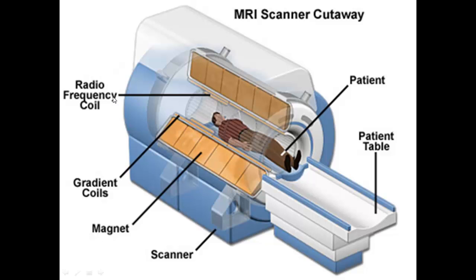And then we use these radio frequency coils to fire radio photons at the person. And we adjust the frequency of these radio photons to be at just the right frequency to excite the hydrogen nuclei that are in this part of the brain. And there will be a very precise frequency, and that frequency will match only the magnetic energy differences of the hydrogen nuclei in this particular magnetic field right there.